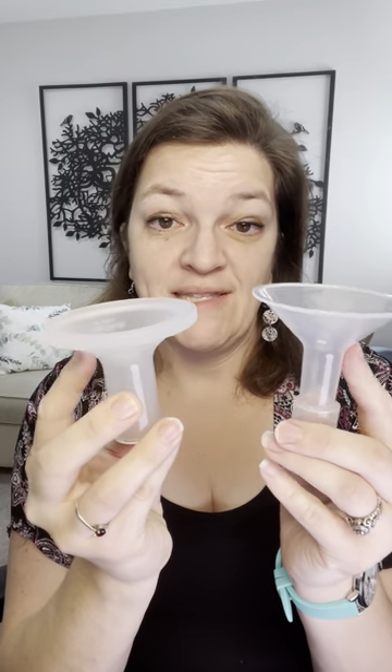Whereas something like the Lactec — this is the same diameter, it's an 18 millimeter diameter, so the hole's the same — but you can see the angle is much different. It's a much shallower flange. It doesn't have as much of a cone to it, which is also different than when you're talking about a 19 millimeter insert, which fits into your traditional flange.